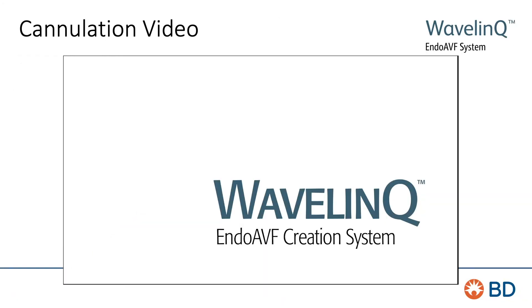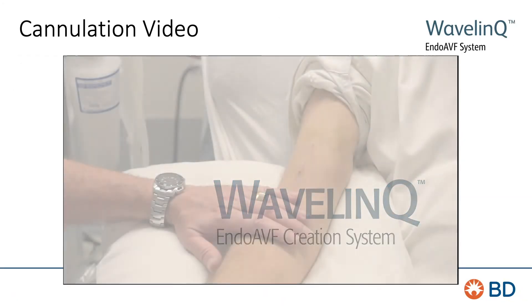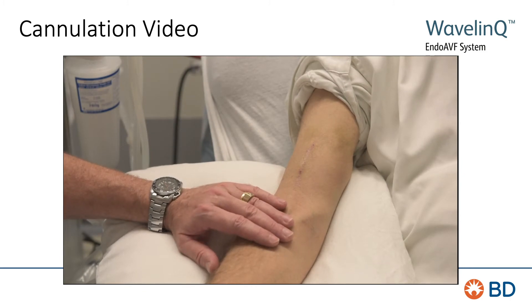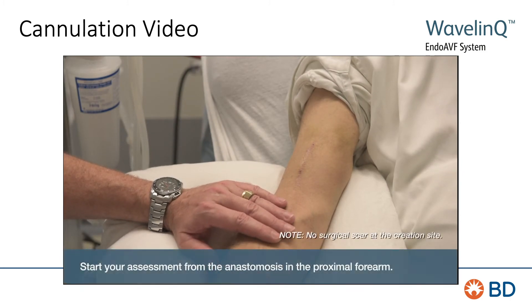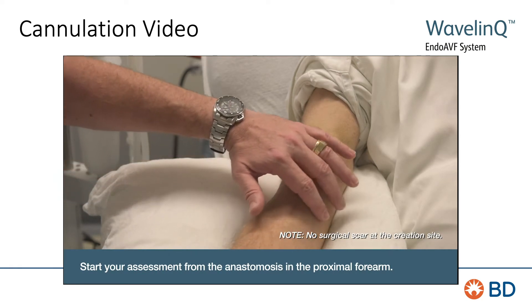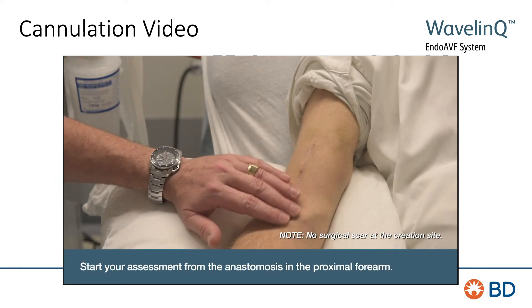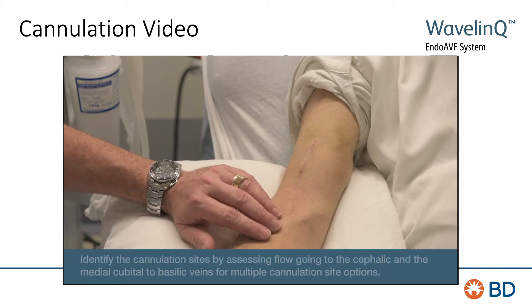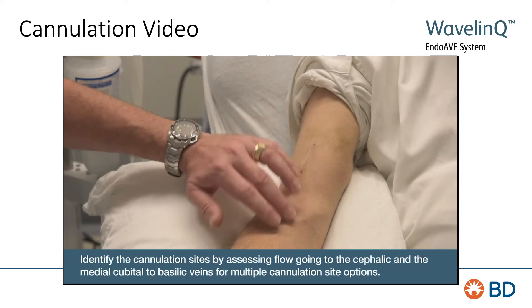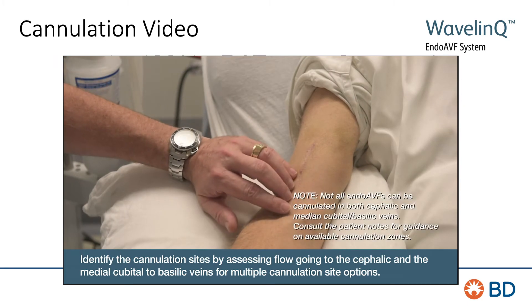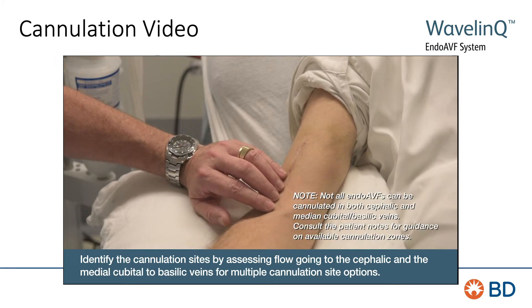This video shows an example of cannulating a Wavelink Endo-AVF. Today I'm going to cannulate an endovascular fistula. You can feel a thrill just over the anastomosis. With an endovascular fistula there's no surgical scar, and because of the configuration, flow actually goes up the cephalic vein and the basilic vein as well, so there are different areas that you can cannulate.